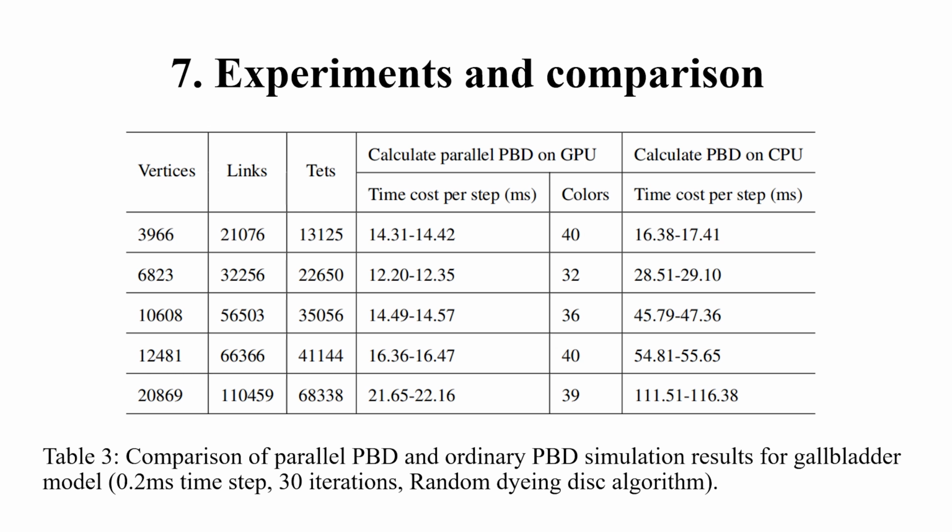However, the improvement of performance using our dyeing algorithm is not as high as we expected. The main reason is that different groups of constraints are solved serially. The second reason is that the number of constraints for each color is not in good balance. It increases the calculation cost.